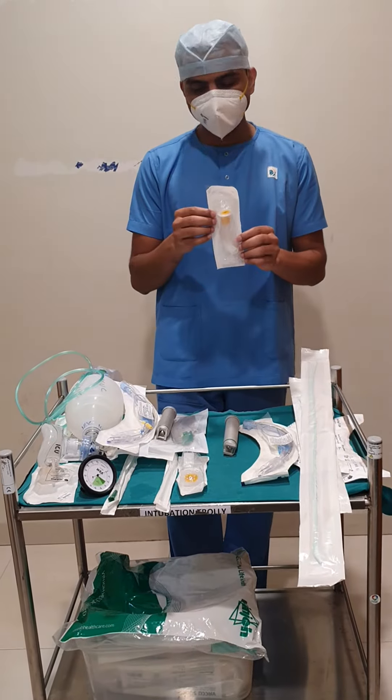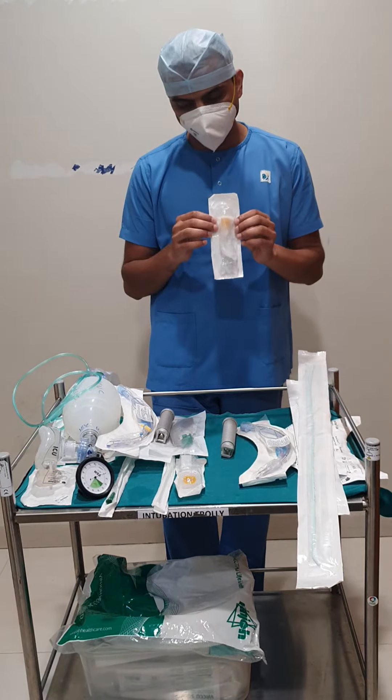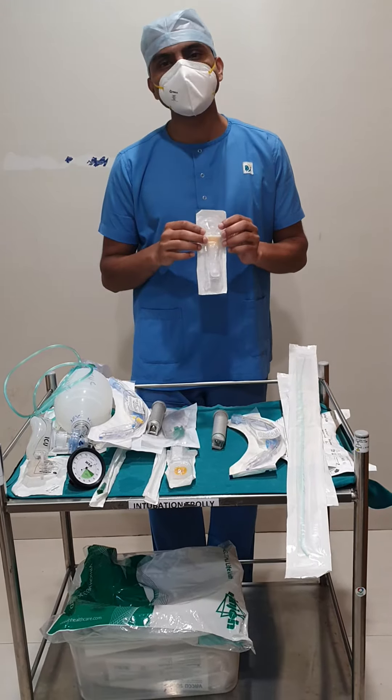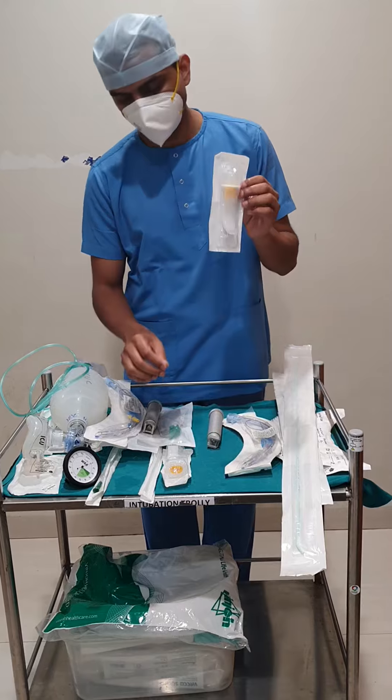This is an oral airway. Usually, we are not using it nowadays because we will be administering adequate paralytic agents to the patient. Still, if the patient is biting, then we will be using this airway.